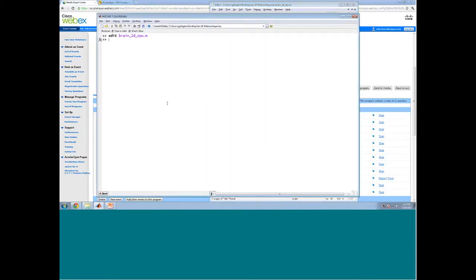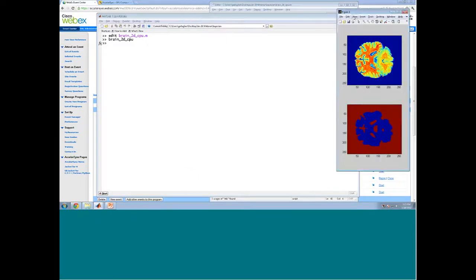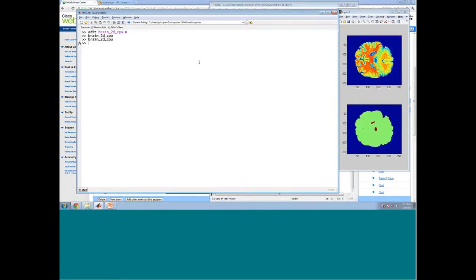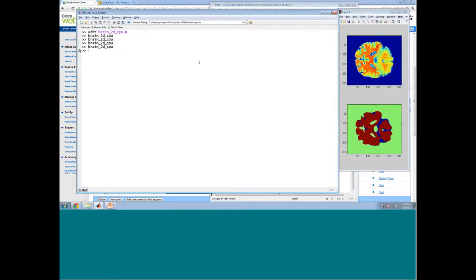I'm just going to go ahead and run this real quick. Here we're seeing the final posterior for each of the 3 classes. Let me run it multiple times. It selects different means every time, so the segmentation is always different. So I'm just segmenting over and over again. You can see we've got one class for the background, one class for the brighter white matter, and then for the grayish areas we have a 3rd class. And this is decent segmentation.